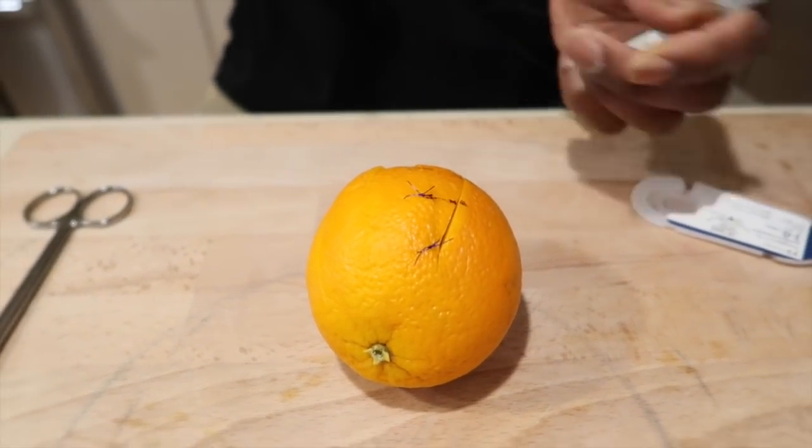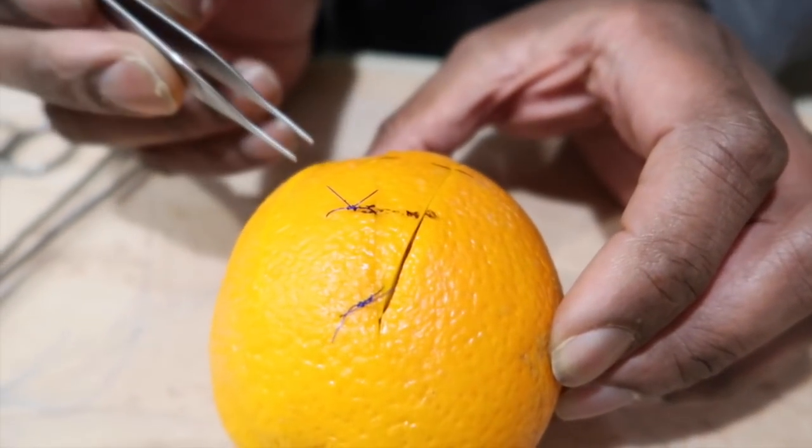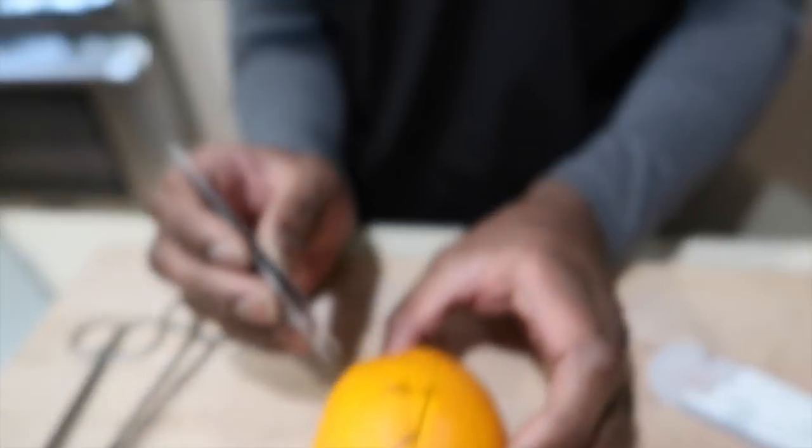When we tie our knots, we always want to try and leave long enough tails so that whoever is going to be taking out the sutures is able to grasp them. If you've ever had sutures that were difficult to take out, one of the reasons is that whoever was cutting them — usually the surgical assistant, scrub tech, or scrub nurse — cut them too short. We always remind them to cut at an appropriate length. This is for sutures on the outside of the body that we're going to cut out. For sutures on the inside of the body, I'll often say 'cut it short,' meaning cut just above the knots — no tails.